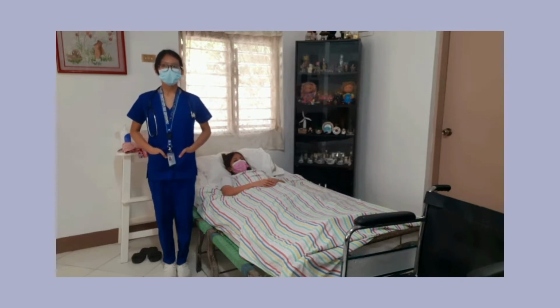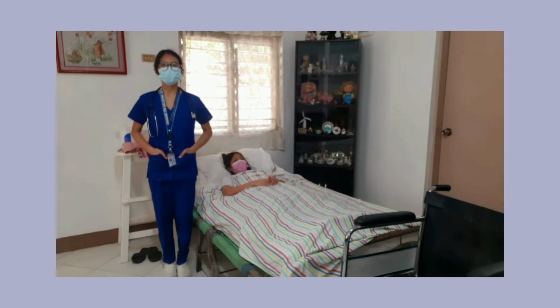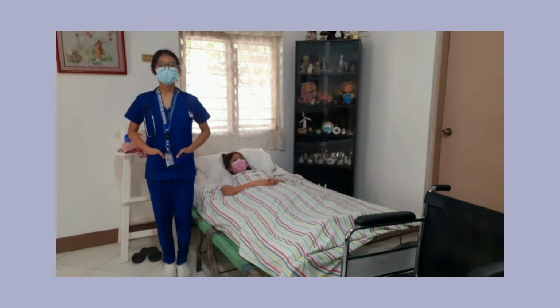Number 2, planning. Implement pain relief measures so that they will be effective when the transfer begins. Number 3, assemble the equipment and supplies needed, such as robe or appropriate clothing, slippers or shoes with non-skid soles, transfer walking belt, chair, commode, wheelchair or stretcher as appropriate to the client's need. And lastly, sliding board if it's available. Number 4, remove any obstacle from the area used for the transfer. Now let's proceed with the procedure.